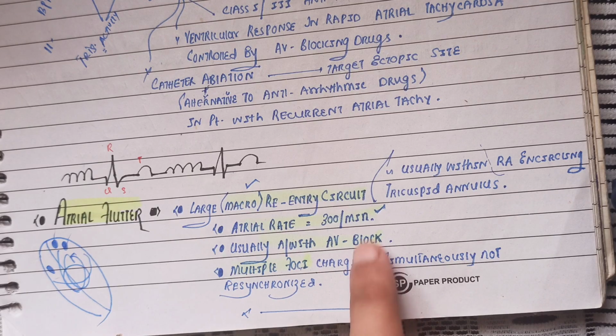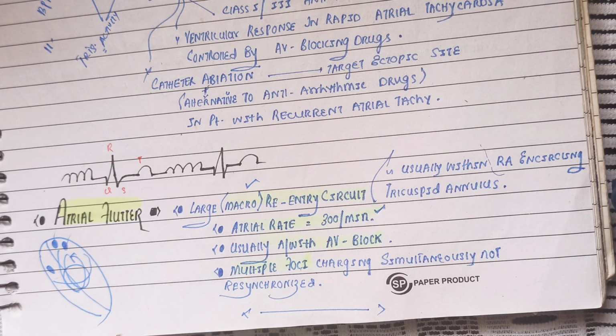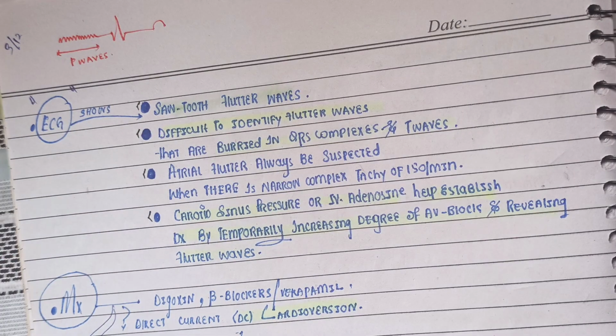sometimes it is associated with the AV block too. What changes on ECG are you expecting? Let me tell you this thing on the very next slide. There we go, with some ECG changes.